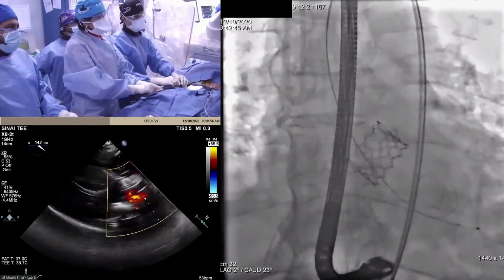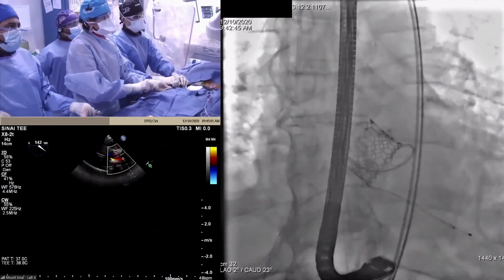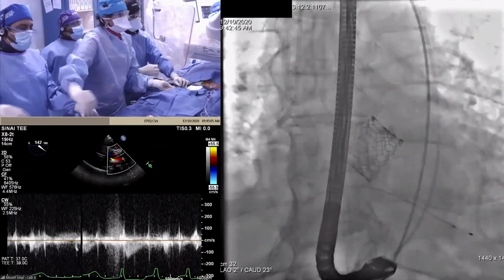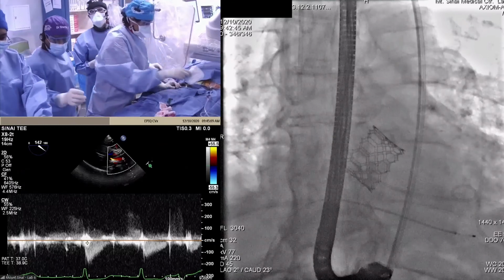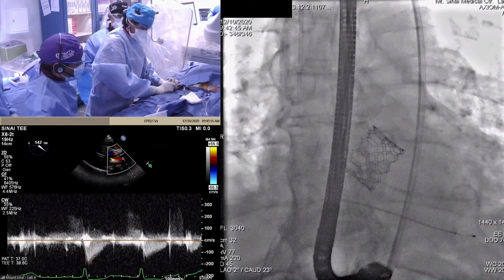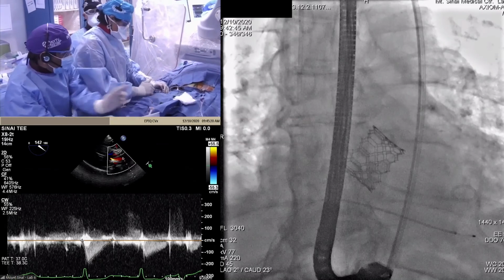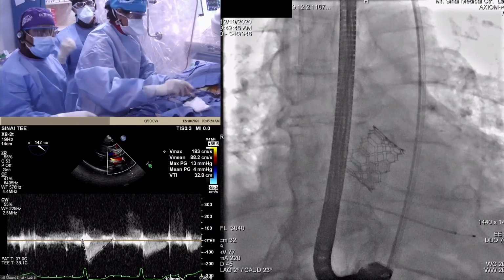So we've actually started doing post-CT in some of these bicuspid patients and shown that even if you add volume to an undersized valve, it really goes up to about 31 millimeters in the frame dimension at most. It's not going to go to 33 or 34 indefinitely. So I think there is going to be some limitation to how big you can expand the S3, at least in the patient versus on the benchtop model.